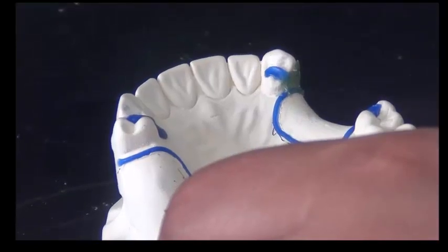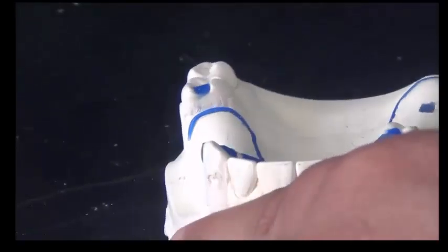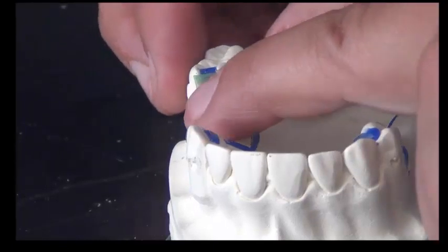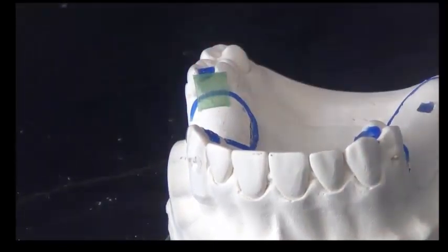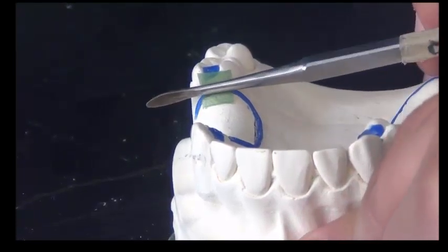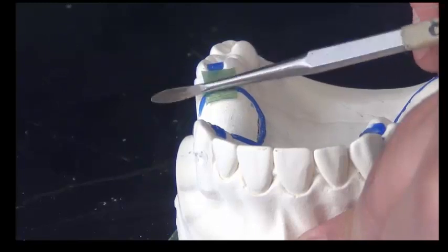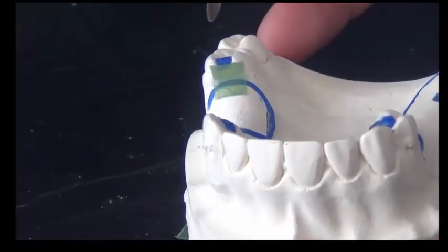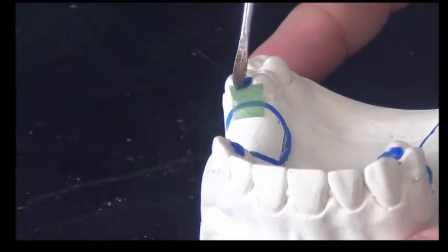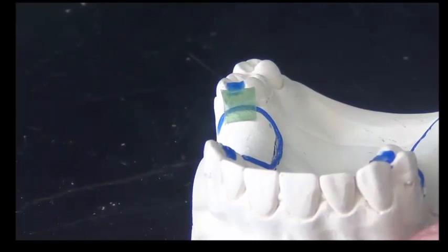They are smooth and they flow with each other. Now on the molar side, I bring a square piece of wax, I adapt it to the surface. I use the back of the instrument to make sure that the corner is filled in with this material. I use the temperature to join between the rest and the new guide plate that I have. So the neck area, I'm flowing with the material from the rest towards the neck area to make sure that this area is thick.